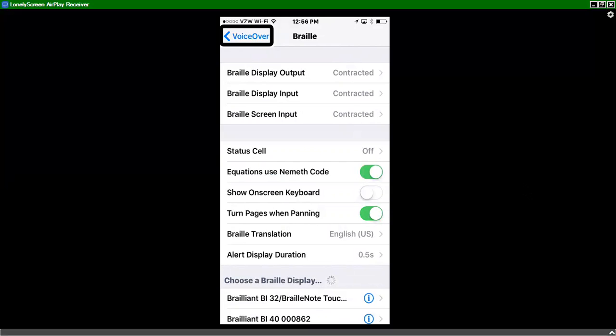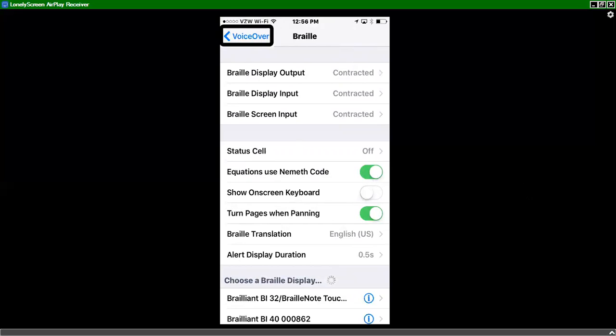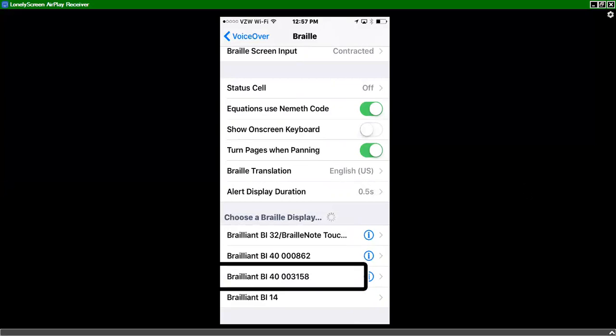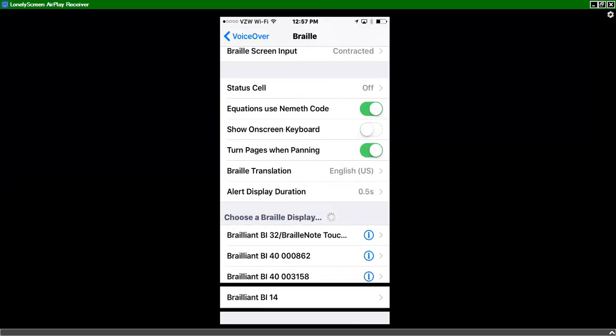And somewhere down at the bottom, I should find my Brailliant Braille display. So I'm going to use three fingers and swipe up to scroll the screen down. Alert. Rows 1 to 13. Okay. And we'll see if at the bottom somewhere, I have a Brailliant 14. Brailliant BI. Brailliant BI 14. There it is.